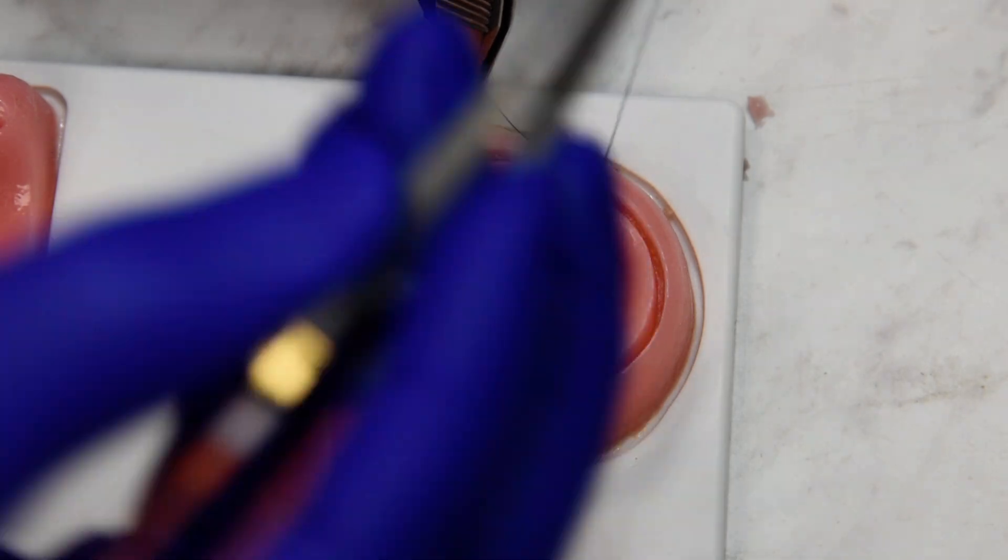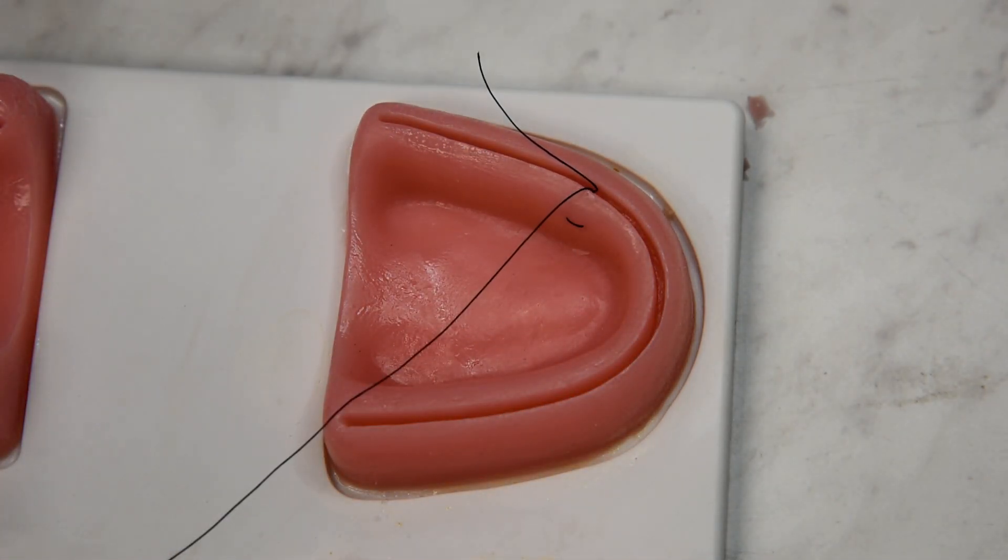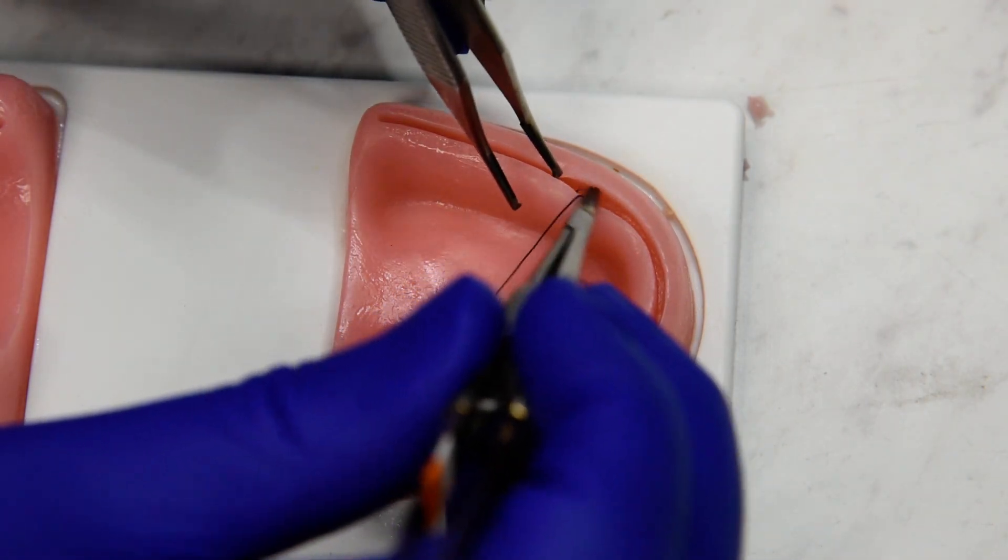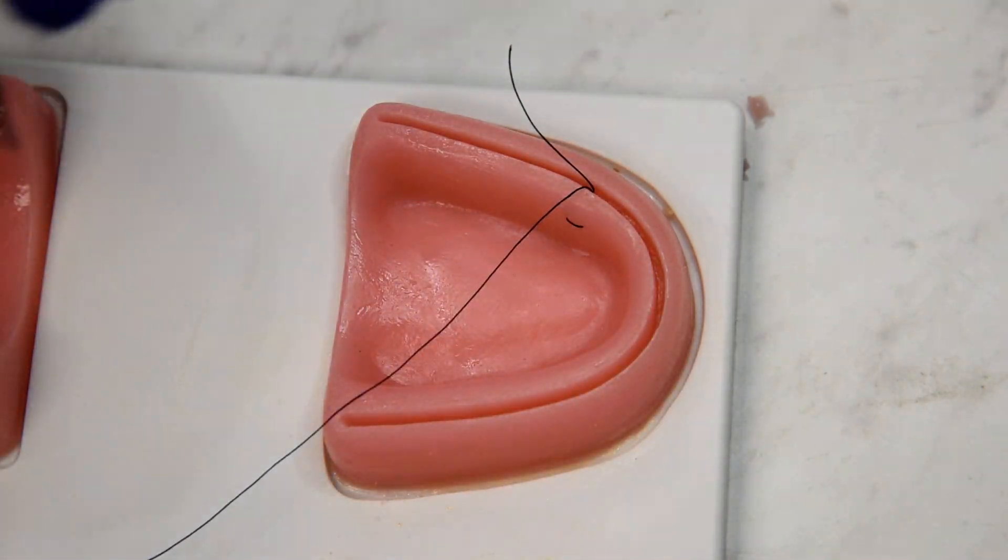And this is really useful for cases where we have bone and membranes here, and we're helping to strap that down.